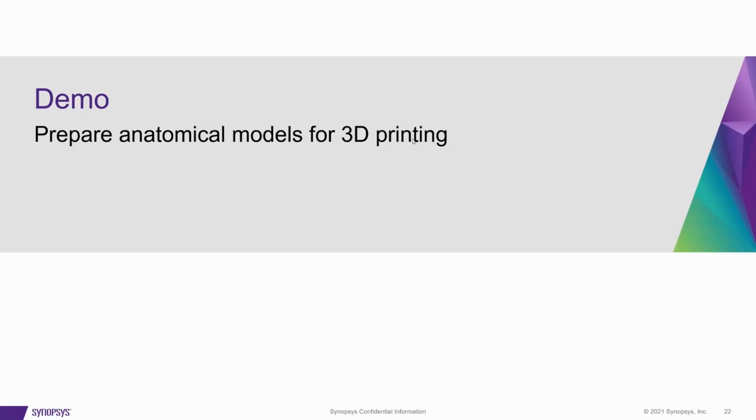So with that, I'm just going to jump into a 5-minute demo of the tools and give you an idea of how they work. It won't be too extensive, but please do feel free to either get a trial or download the software, get in touch with support to find out a bit more about these tools and how they could be helpful for your end-to-end workflows.